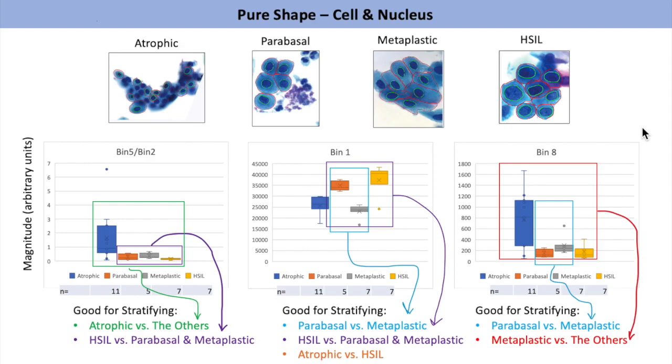So I'd like to remind you that our goal is to show that Shape Genie can produce clear data separating these in-between categories that can be very difficult for a pathologist to objectively identify when examining these cells under a microscope. Shape Genie can provide clean data such that 1, we can identify unknown substages, and 2, we can develop automated machine learning models that will analyze PAP smear images to help pathologists speed up the process of diagnosis. Furthermore, once we identify substages or subgroups, that will help us develop and test improved therapies.